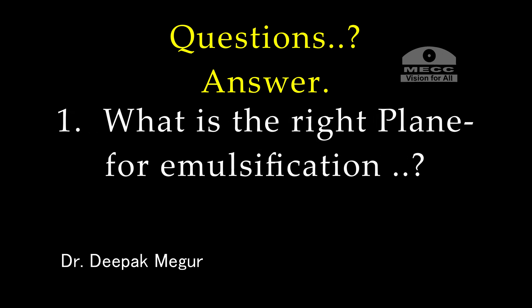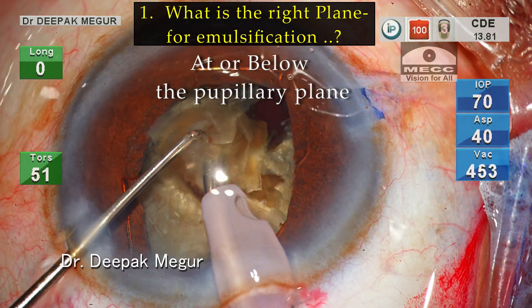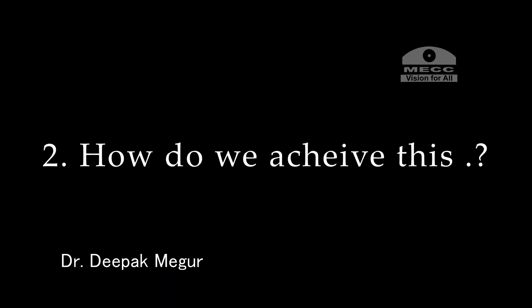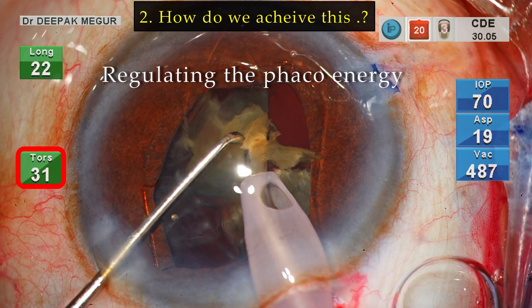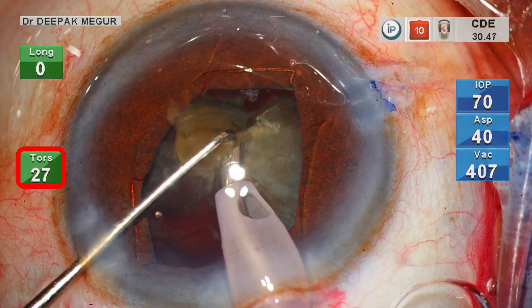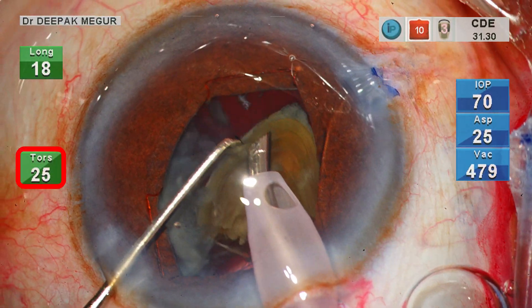So to answer the question — what is the ideal plane of emulsification of the nucleus? It has to be at or below the pupillary plane in most case scenarios. And how can we achieve this? This is possible by regulating the amount of energy used to emulsify the fragment, and typically this is done with the surgeon using his foot to control the amount of energy being delivered.